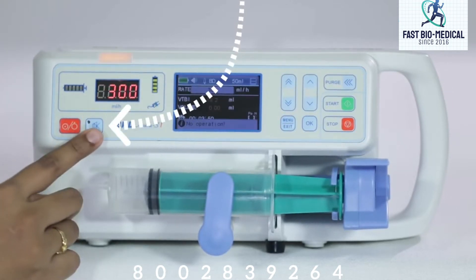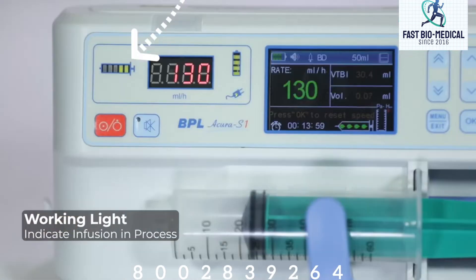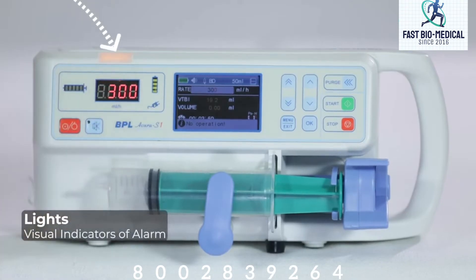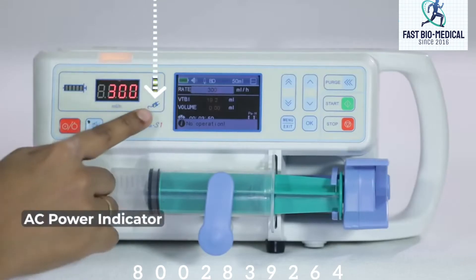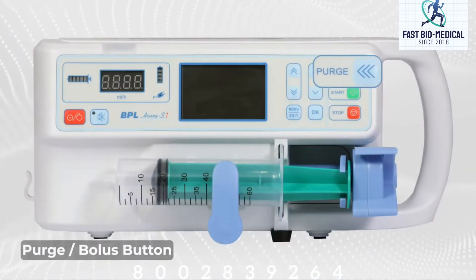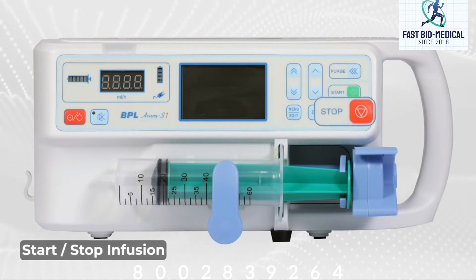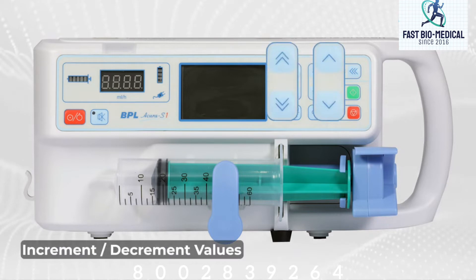This is the audio pause button to silence the alarm. This is the working light which indicates infusion in process. This is the light for visual indicators of alarms. This is the battery indicator and this is the AC power indicator. This is the purge or bolus button. This button is to start the infusion and this button is to stop the infusion. These are the keys used to increment or decrement values.